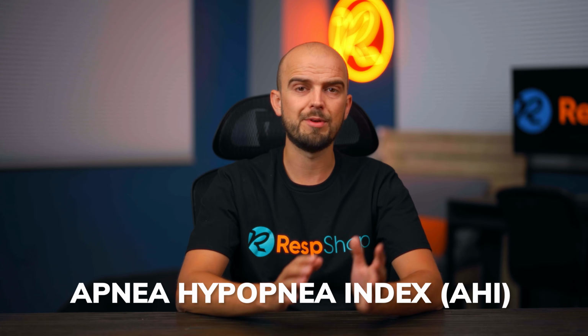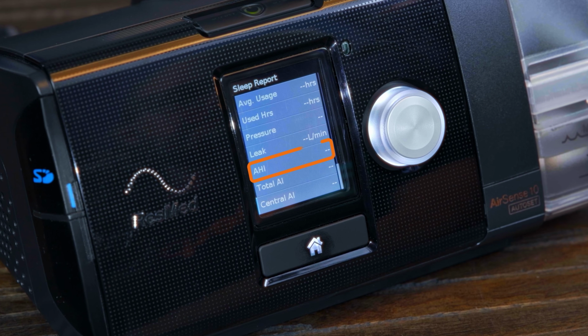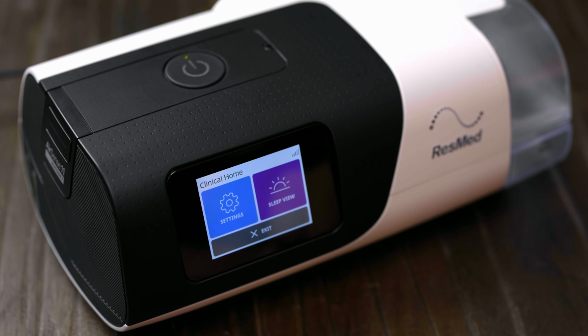If your apnea-hypopnea index, or AHI, which measures your apnea events and appears in your sleep data, is 5 or less, it should be fine to reduce the pressure settings just a little. But especially for beginners, talk to your doctor about that before adjusting any of these settings yourself. Separately to this, you can also use pressure relief settings on your exhale if your machine allows it.